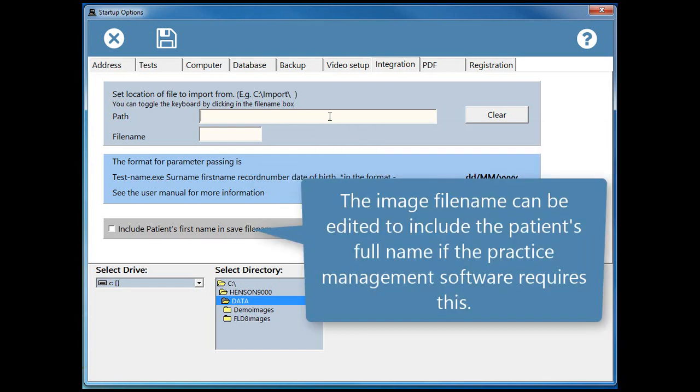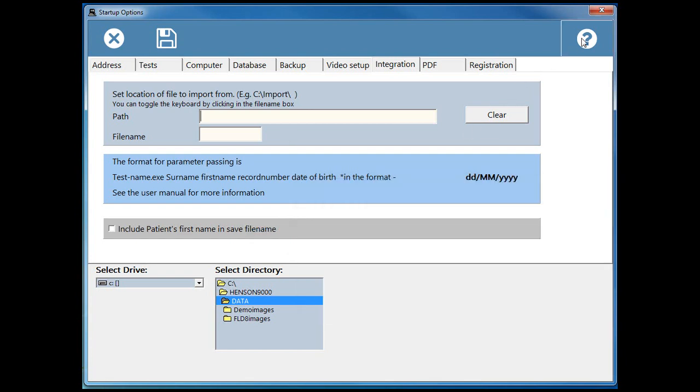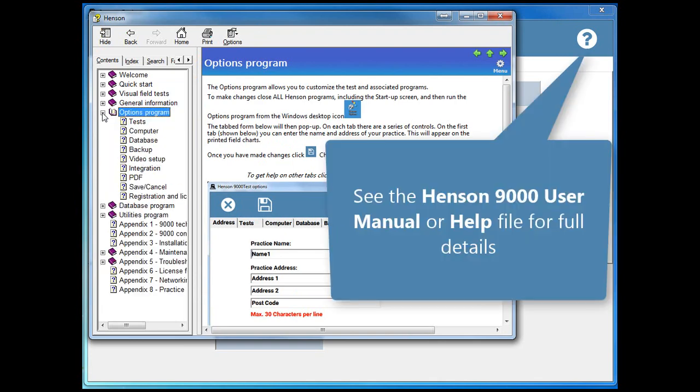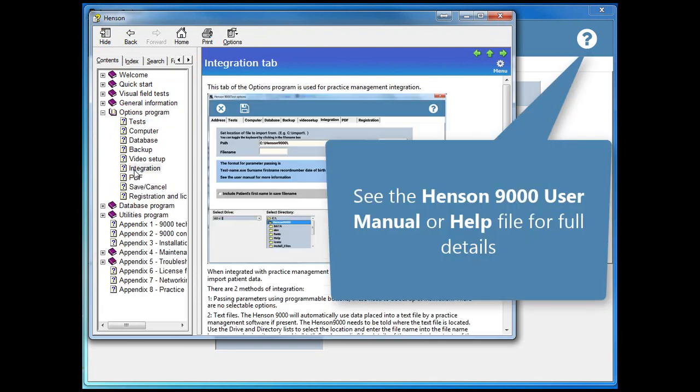The image file name can be edited to include the patient's full name if the practice management software requires this. See the Henson 9000 user manual or help file for full details.